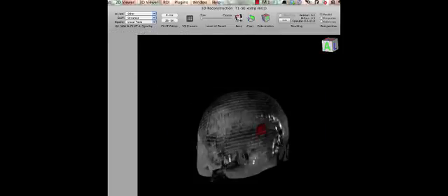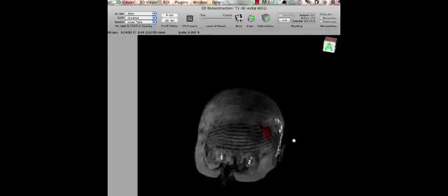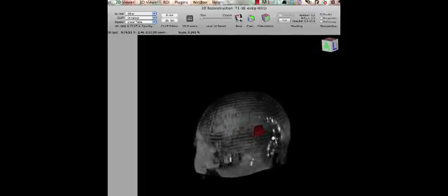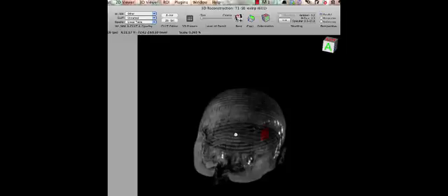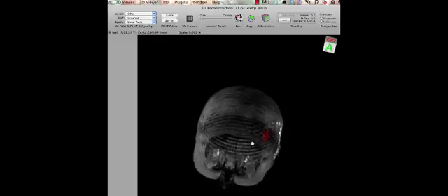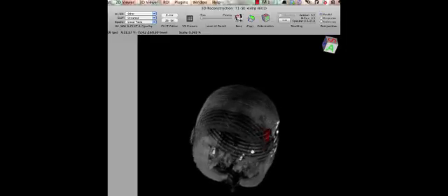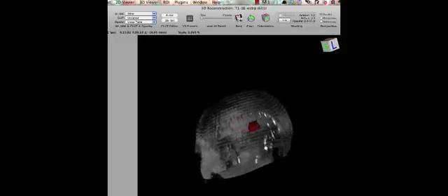So now we have achieved what we wanted to achieve. We have created the 3D model of the head and we have highlighted the lesion. And now we can see the lesion in relation to the rest of the head and get a better idea.